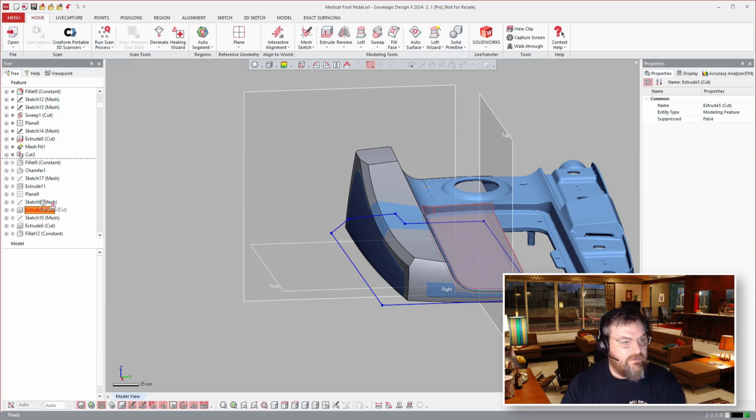So you'll notice that we did a chamfer, fillets, and some more extrude cuts. Once this finishes recalculating, you'll notice that the extrude cut is this pocket here, that they went ahead and cut that away as well.